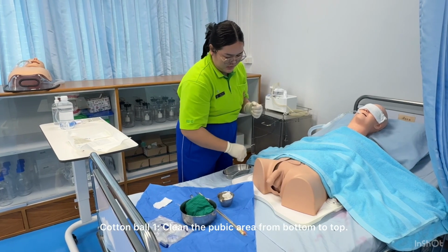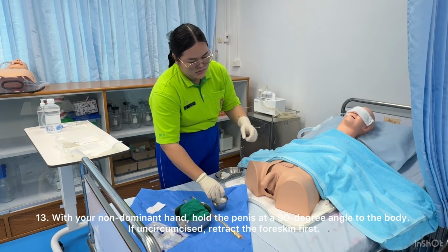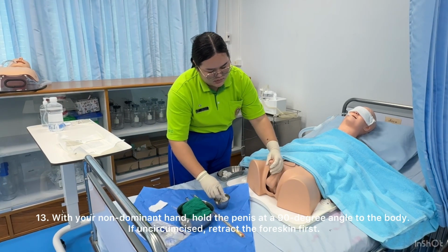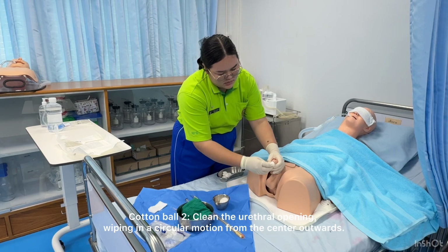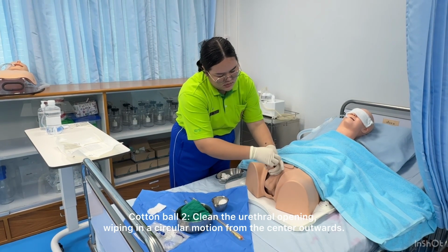Cotton ball 1. Clean the pubic area from bottom to top. 13. With your non-dominant hand, hold the penis at a 90-degree angle to the body. If uncircumcised, retract the foreskin first. Cotton ball 2. Clean the urethral opening, wiping in a circular motion from the center outwards.